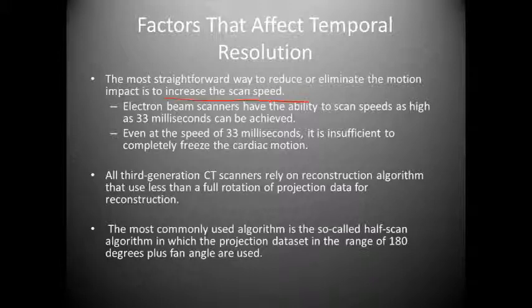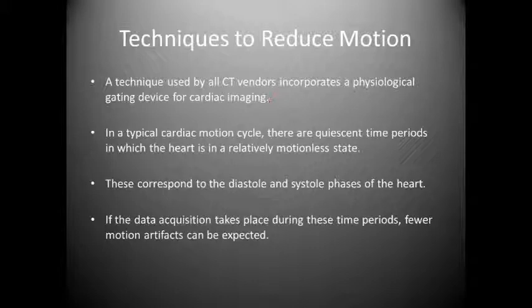So basically, even the fastest thing that we have does not have the ability to image the heart with a high degree of accuracy. Because of that, we're still working on temporal resolution because we do not have the ability to freeze motion. That's where cardiac gating comes into play. They're making progress all the time, but we're still waiting to see all of the significant progress.